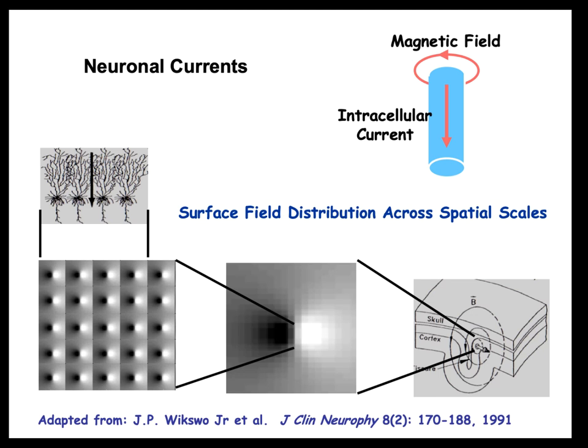When you use MEG, magnetoencephalography, you're detecting magnetic fields at the scalp. That started with a dipole. Somewhere in the brain, there's a dipole, and the dipole is hypothetically produced by intracellular current along dendrites. That's one model, sort of the leading one. And whenever you have a current, it produces a magnetic field around it. And so that magnetic field around these dendrites produces magnetic field distortions when you're in a magnetic field. There's no susceptibility effect. It's purely an additive magnetic field that looks like a susceptibility effect, but it also dephases spins.